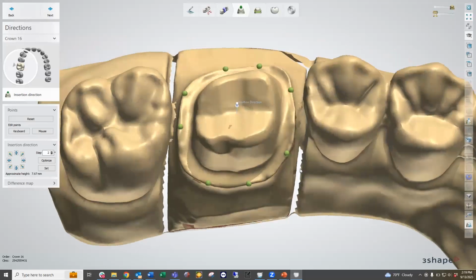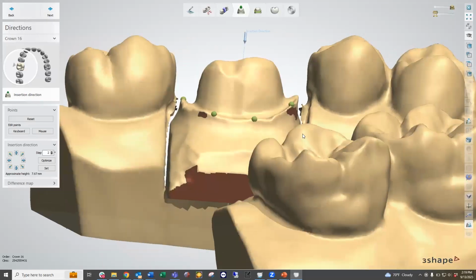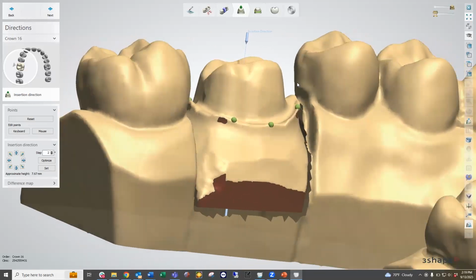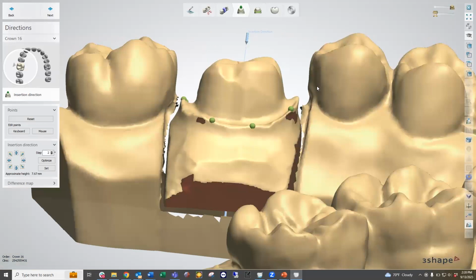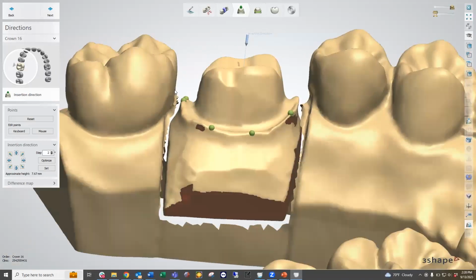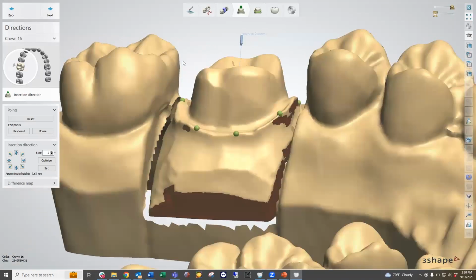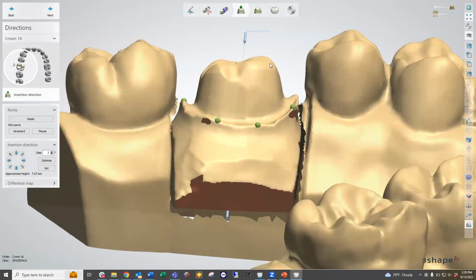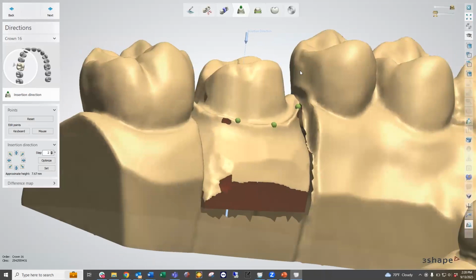One thing I like to do at this stage is see the reference between my axial walls and my neighborhood interproximals. I take a look and make sure that I'm not creating any undue undercuts relative to my axial walls or my neighboring contacts, because I don't want something to be overly undercut in this area where we would only have a pressure point contact on the marginal ridge. So I want this to be really identifying the true path of insertion, looking at all aspects with the axial walls of our preps as well as our neighborhood scan.